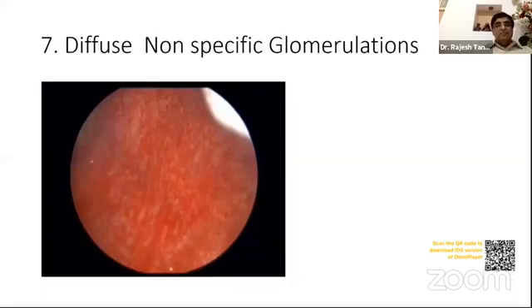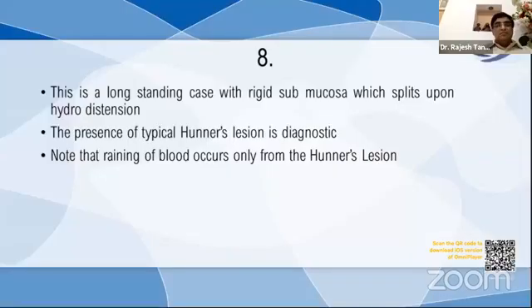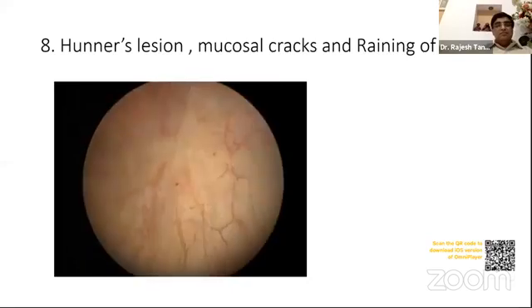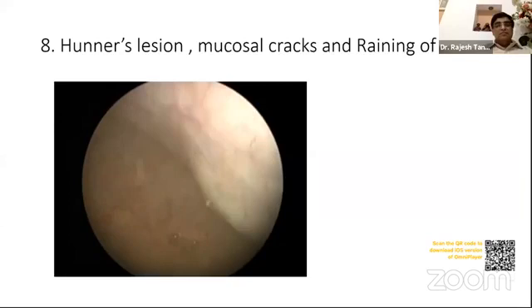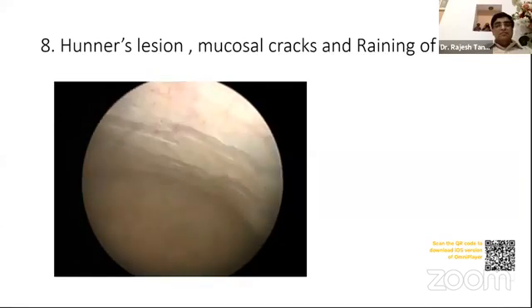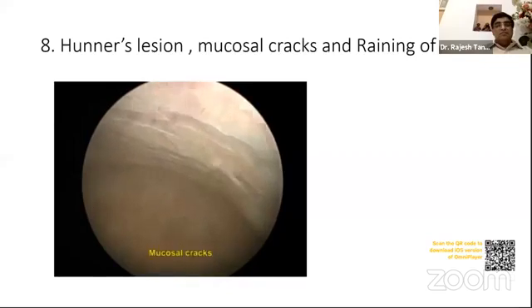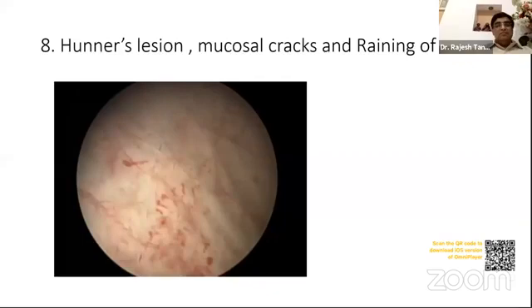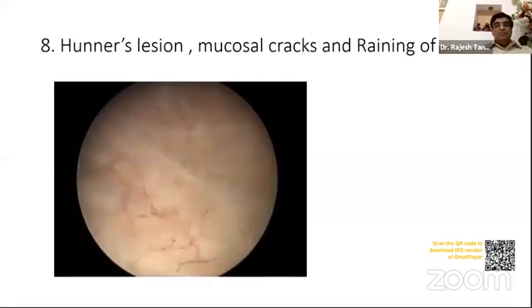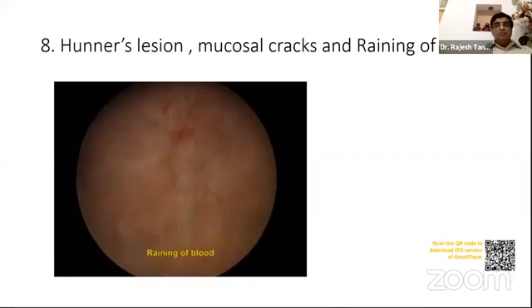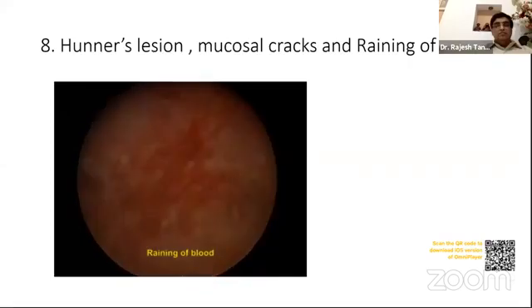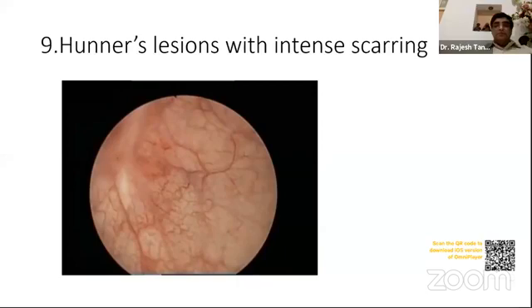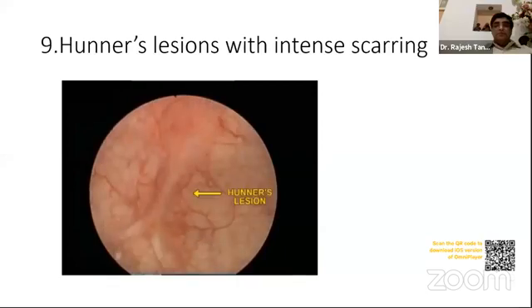This is a long-standing case with a rigid bladder. Upon hydrodistension, the presence of a typical Hunner's lesion is diagnostic. Note that draining of blood is only from the Hunner's lesion. This is a long-standing case with multiple Hunner's lesions and a fibrotic bladder. Note the appearance of Hunner's lesions compared with the early cases depicted earlier in this video.